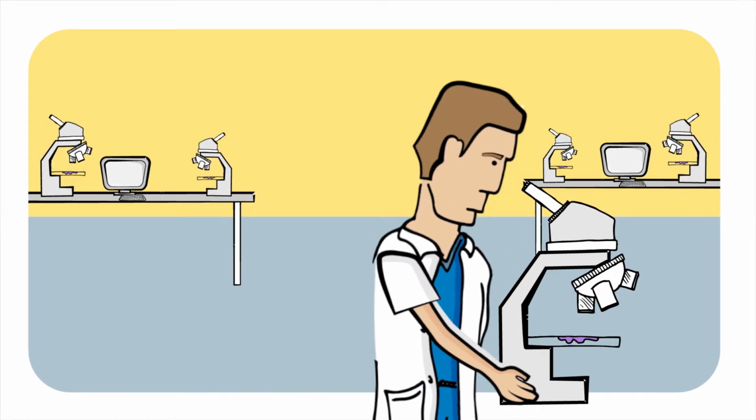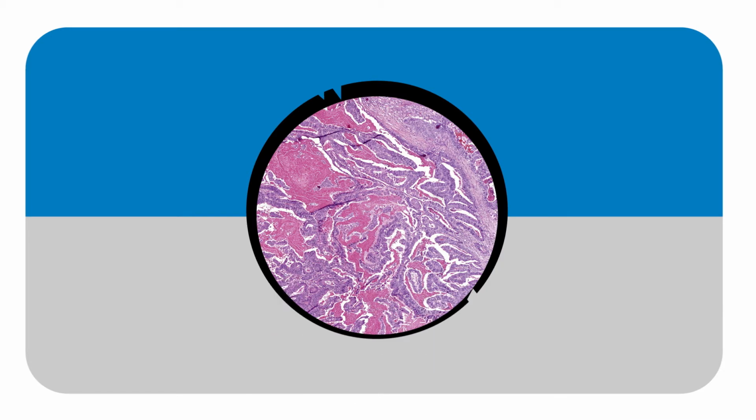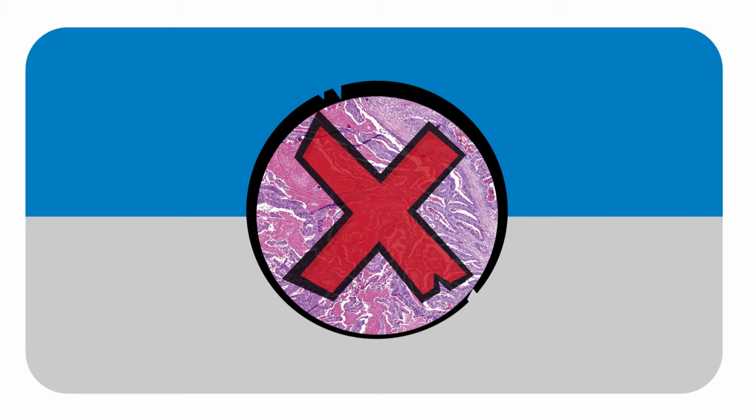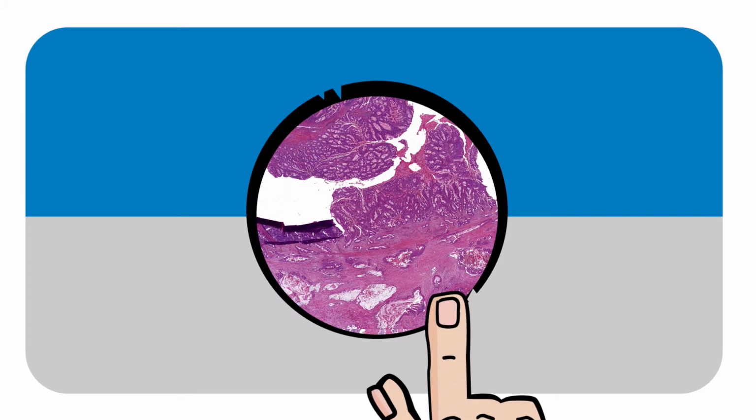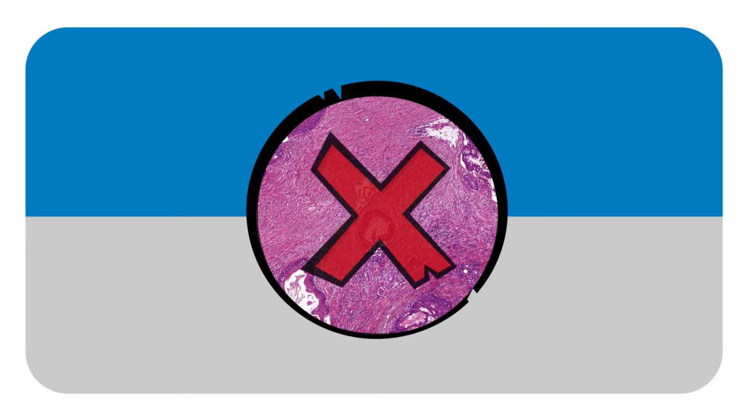When determining the tumour-stroma ratio, a number of aspects must be taken into account. Attempt to observe an area with as little necrosis or muscle tissue as possible, or preferably even none at all. Sections containing muscle tissue may resemble stroma but must not be assessed as such.